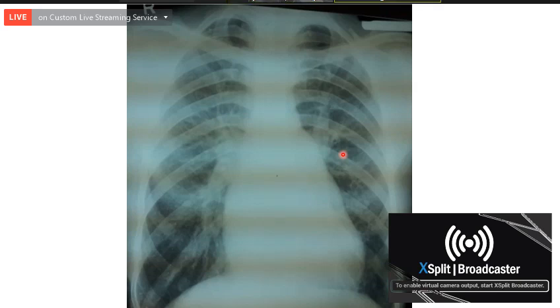So in this patient, upper vessels are prominent, Kerley B lines are there, and also there is a suspicion of a ground glass appearance. This area is definitely much more opaque compared to the lower area. So there can be some degree of ground glass appearance in the mid zone. Okay, all put together, diagnosis?